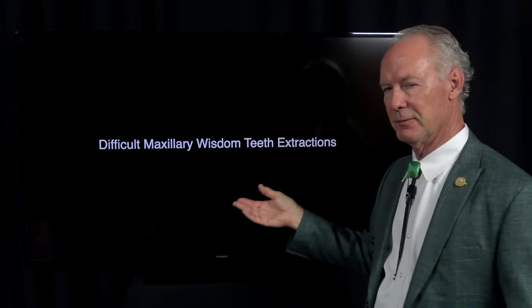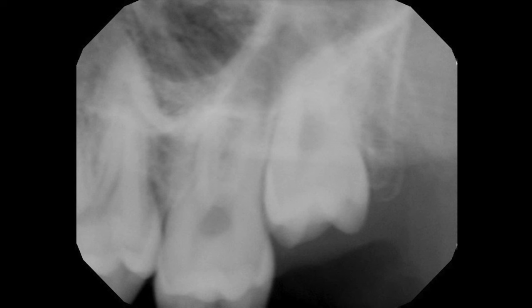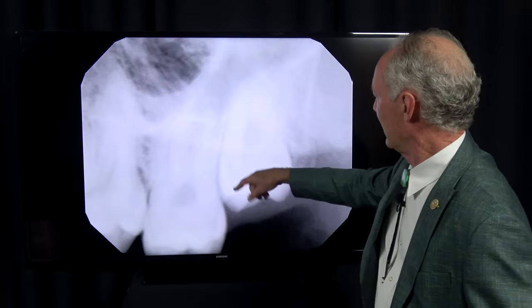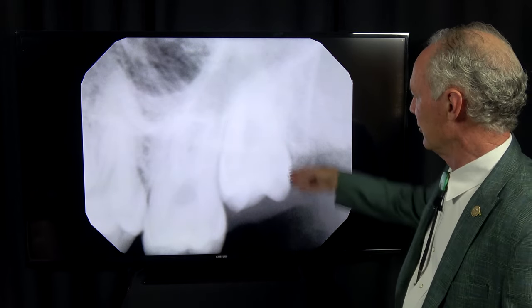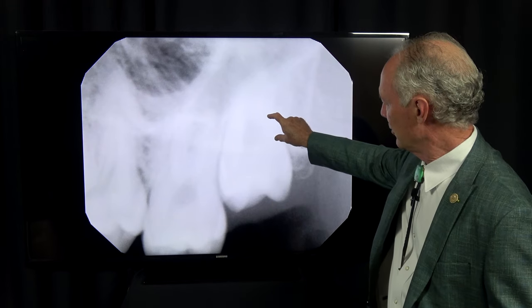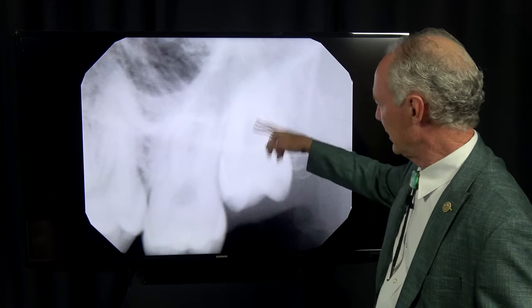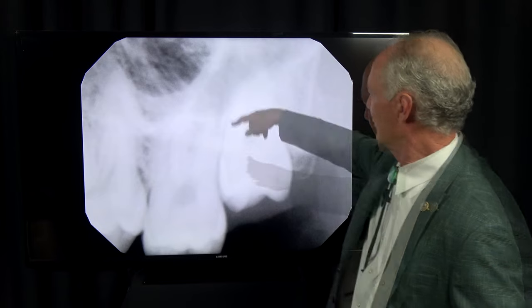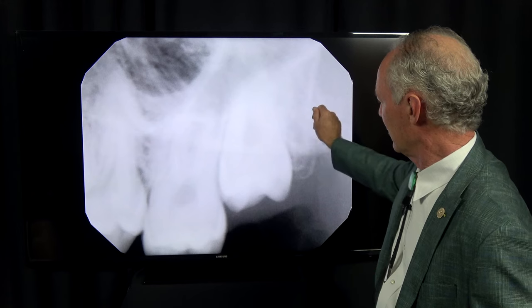These are a couple of maxillary wisdom teeth that were very difficult. They were impacted up against the teeth in front of them, with fully formed roots. This young man was about 20-something, so when the roots are fully formed it makes everything more difficult. You'd normally like to extract an impacted wisdom tooth when the root is about 25% formed — that keeps the tooth from spinning and the roots aren't wedged in against the bone, so you can roll it out.